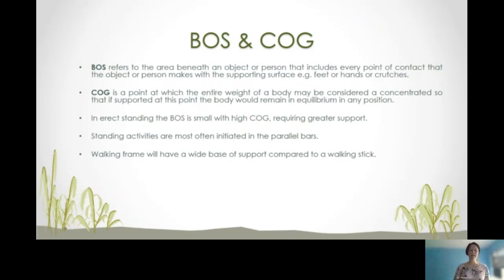That is the reason why it is often a challenge to stand up and just start walking. But a walking frame will have a wide enough support compared to crutches or a simple walking stick. But maybe it's just a walking stick or a cane that your patient needs to move around with. And then that is sufficient for your patient.